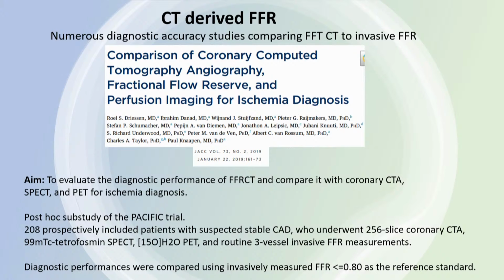What about studies that have actually established that this is diagnostically accurate? There have been many accuracy studies comparing CT FFR to invasive FFR, which would be the gold standard. One of these, from Jack in 2019, looked at the diagnostic performance of FFRct and compared it with coronary CT alone without FFR information, SPECT and PET for ischemia diagnosis.